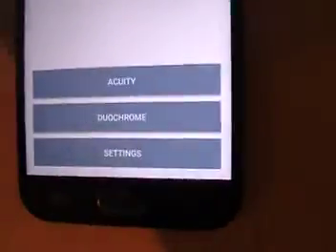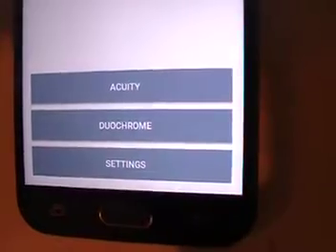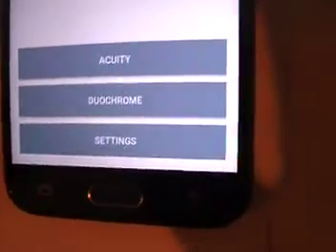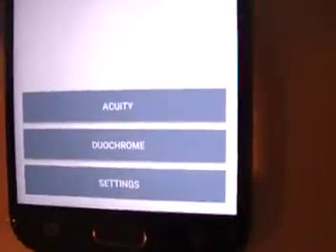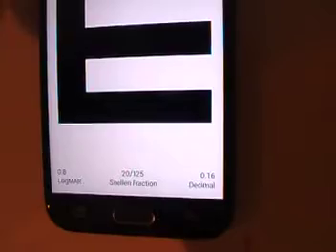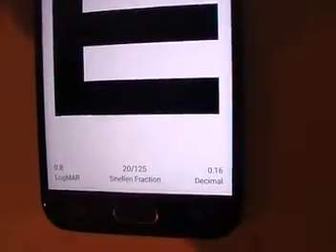What you see is Acuity, Duochrome and Settings. We will hit Acuity and what you have is tumbling E's. In this case it shows 20/125.